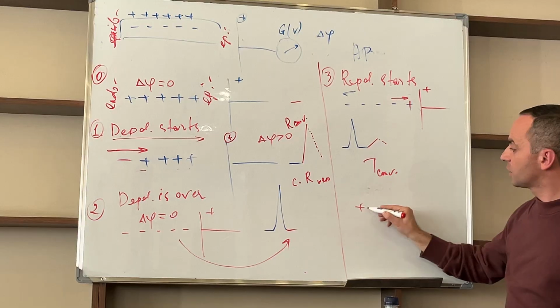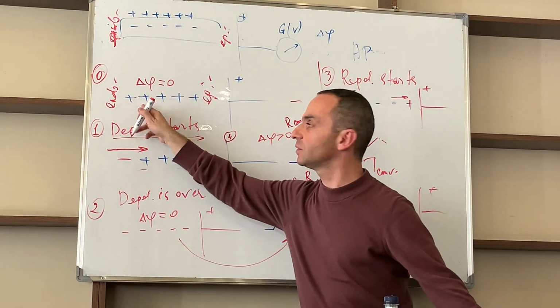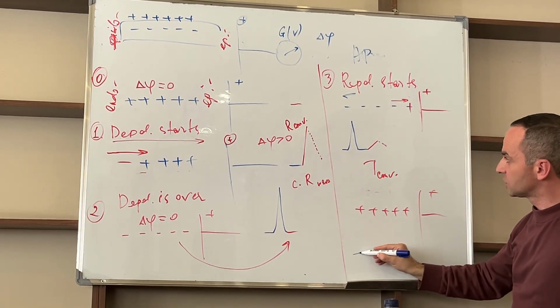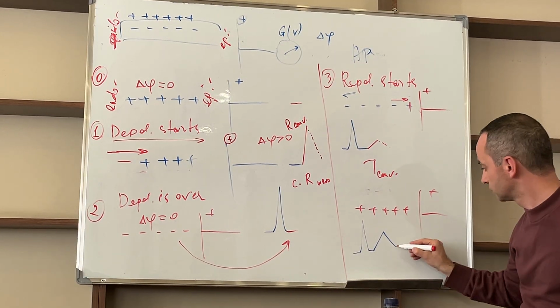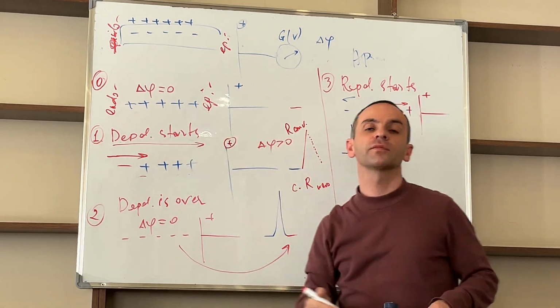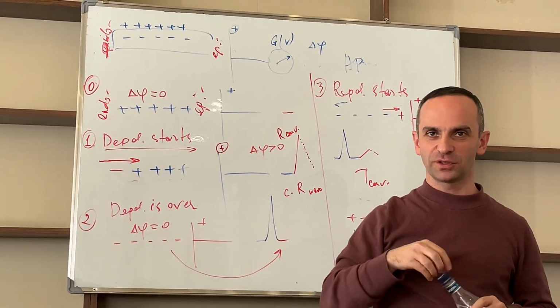Then when everything becomes positive, we have again an isoelectric line, the same as here. Look, we started from here, T, then for example this starts. Again a flat line. It is the start of another QRS complex, yes? Was it clear? It is very important, because just now we'll do it for the whole myocardium. Remember this.